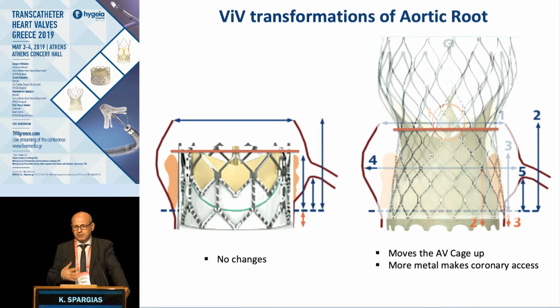Of course, what comes first is the safety of the procedure, because you need to have an alive patient after 10 years to need a second procedure.